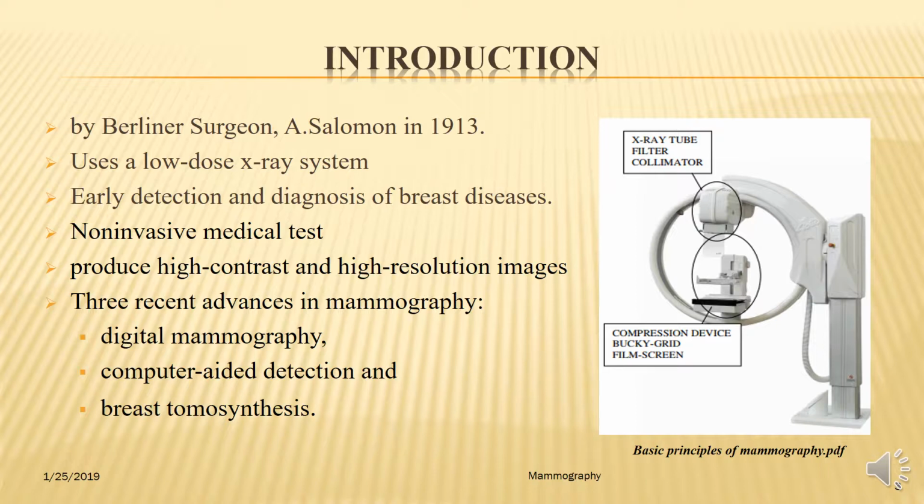The other system is a computer-aided detection system, which searches digitalized mammographic images for abnormal areas of density, mass, or calcifications that may indicate the presence of cancer. The computer-aided detection system highlights these areas on the imaging, alerting the radiologist to carefully assess them.